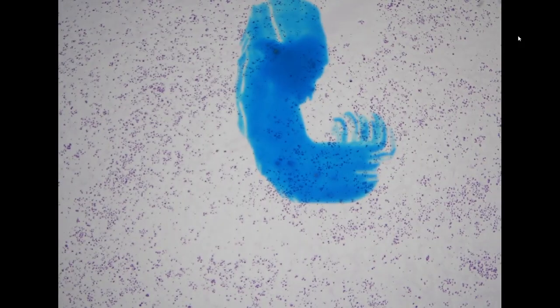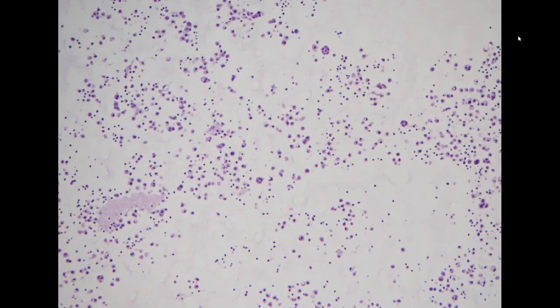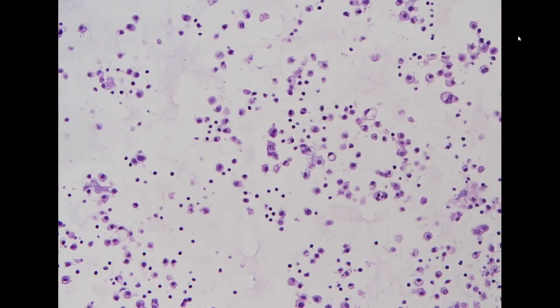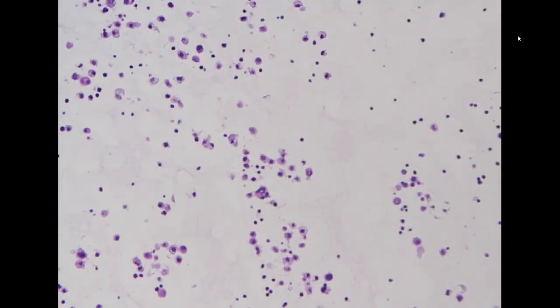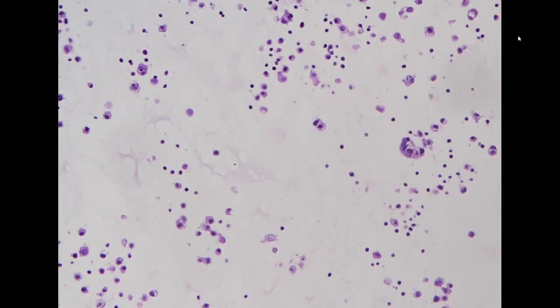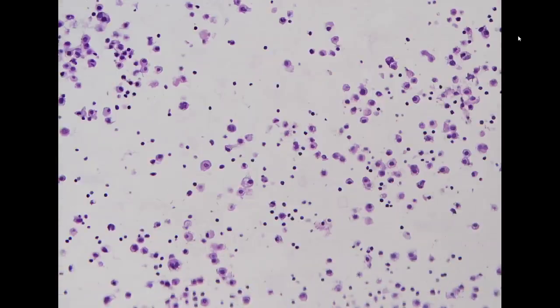When we go to the cell block preparation, it is also not very easy to identify which are the cell clusters that we see in the specimen. Could be these very tiny clusters of cells. He is a male patient. The clinician didn't see anything yet. They suspect there is stomach cancer, but he has received three stomach biopsies, and they were all negative, so it's kind of difficult. It's a little bit weird. So we go ahead and do a MOC31.